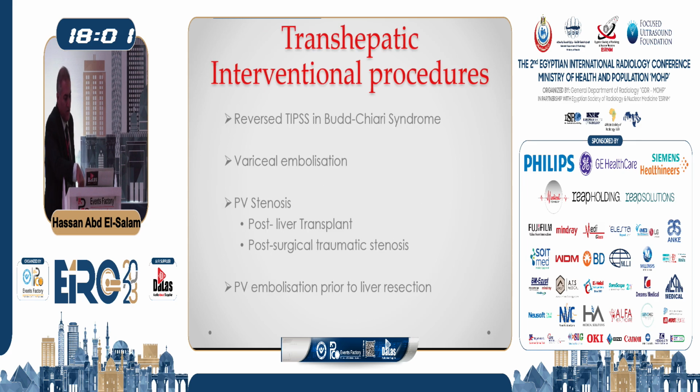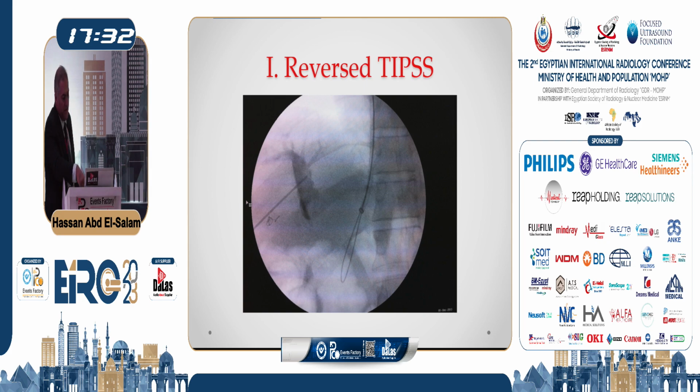So we are talking today about the transhepatic interventional procedures. You can either do a reverse TIPS in Budd-Chiari syndrome. You can do transhepatic variceal embolizations, portal vein stenosis treatment, either post-transplant or post-traumatic stenosis, and portal vein embolization prior to liver resections.